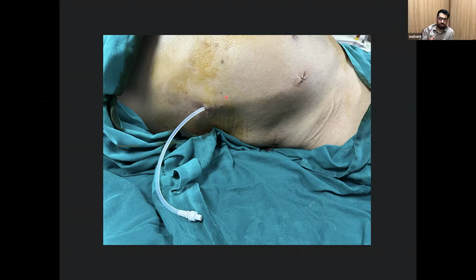So all sizes of catheters are available, and the Seldinger technique provides us with a very safe technique of introducing these things. And the coaxial technique for biopsy gives us minimal pain, a single puncture, and multiple biopsy samples. So all in all, the basics of FNACs, biopsies, drainages, the basics of the needles, how the guide wire is introduced into these needles, how the coaxial technique works, and what the Seldinger technique is, give us a brief about how these procedures are done in non-vascular cases.